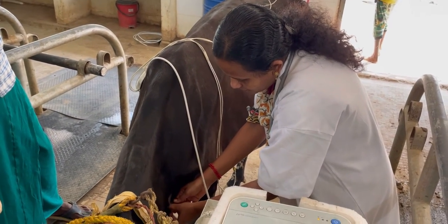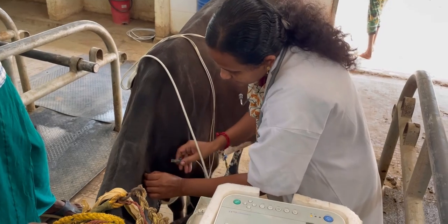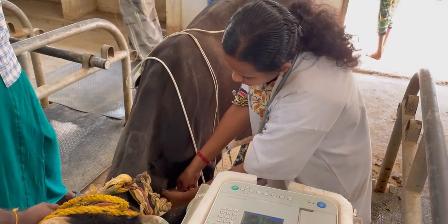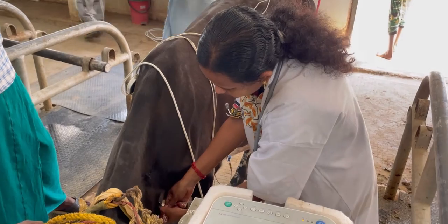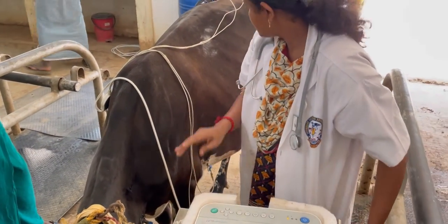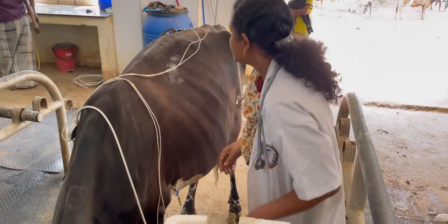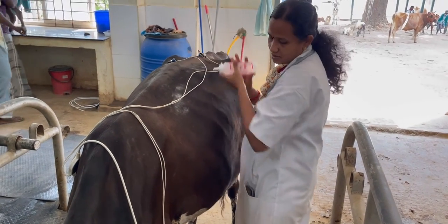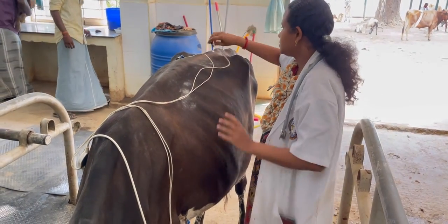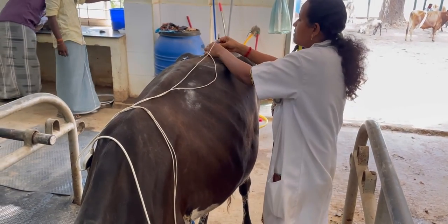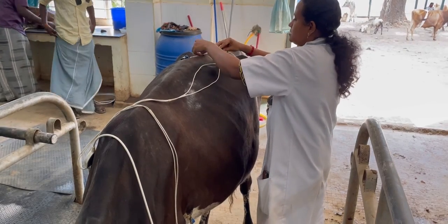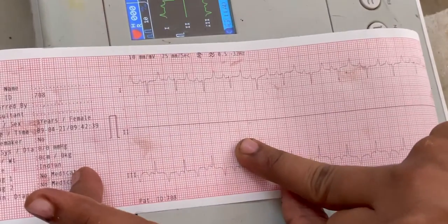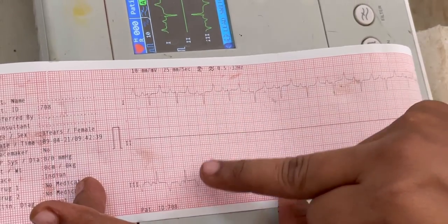The negative electrode, representing the right arm, is attached to the jugular furrow at one third of the neck on either side or at the mid-neck. The neutral electrode should be placed away from the heart. Here you can see the base-apex lead system using limb lead one.